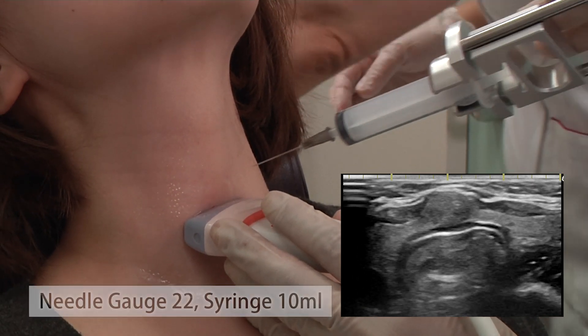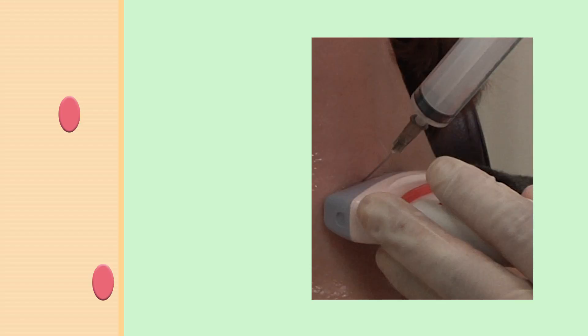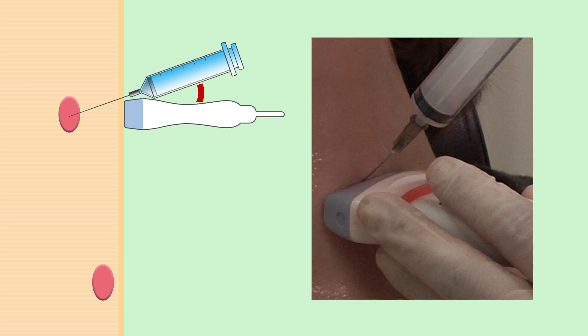Next, we insert the needle. When we insert the needle, for a deeper nodule, we consider a narrow angle between the needle and probe. Whereas, for a superficial nodule, we consider a wide angle.